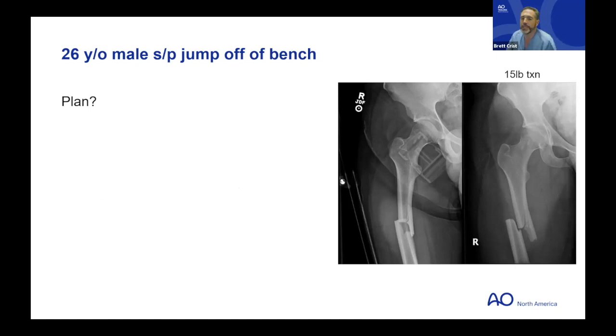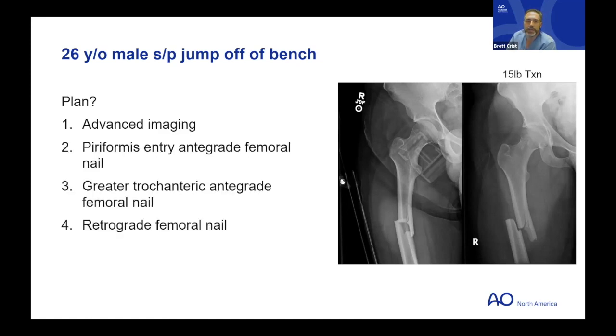And so what's the plan? This again seems like a pretty straightforward femur fracture, similar to the one that Mitch showed initially. And so what thoughts do you have? This came in on a Saturday. One of my partners is on call.